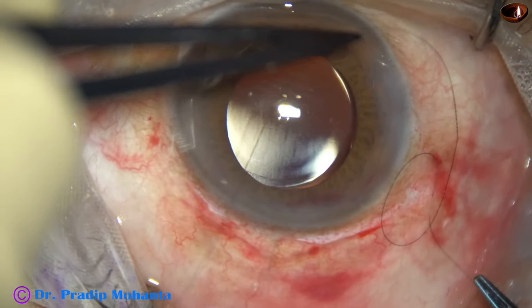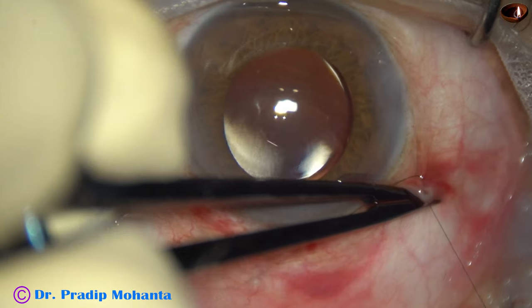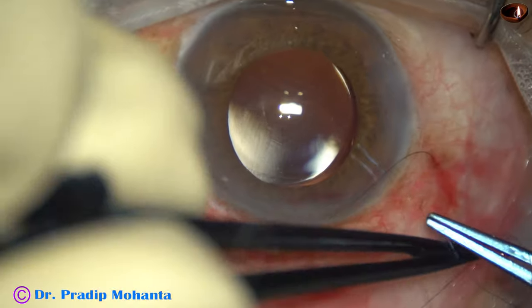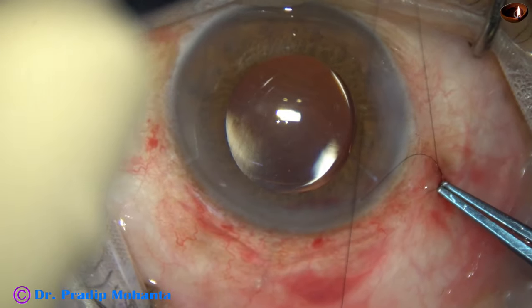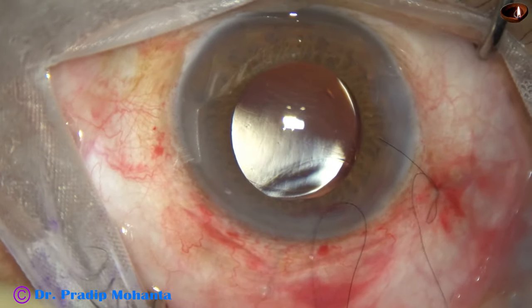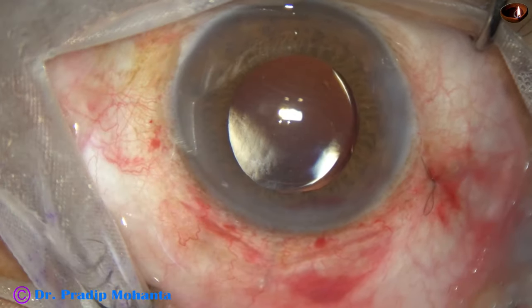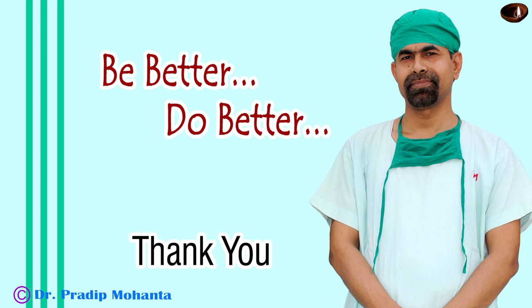This video is dedicated to my African colleagues who do extracapsular cataract surgery routinely. Please use this technique — you will need only one suture. You may put a maximum of three sutures: one at the apex and one more on either side. More than three sutures is not necessary. If you put a releasable suture and remove it after three days, that is fine. The case is concluded. Thank you very much for your attention.